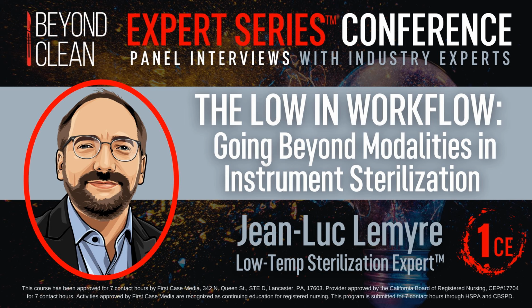I've seen and talked to a lot of people in the industry about using hydrogen peroxide sterilizers and people getting a hydrogen peroxide burn on their fingers, and their finger turns white because they handled something that came right out of the sterilizer and weren't wearing gloves when they were doing so. And who knows what or why, but it sounds like one of the possible causes is that they didn't have their instruments dry enough before it went in there. Yeah, typically I think that would be the cause for it. Yeah, for sure.